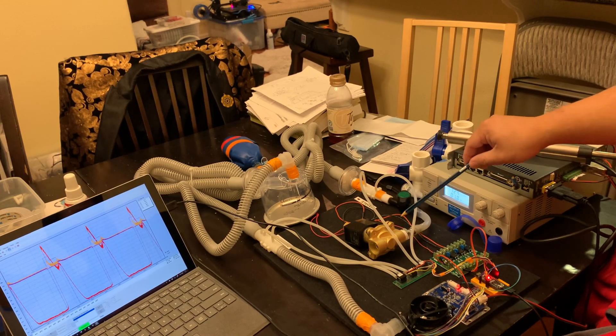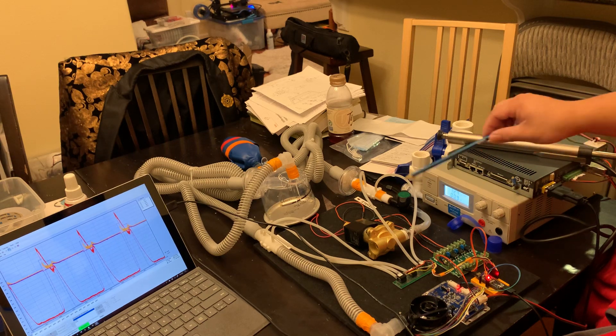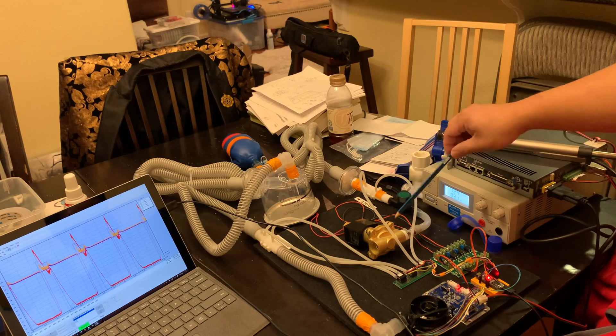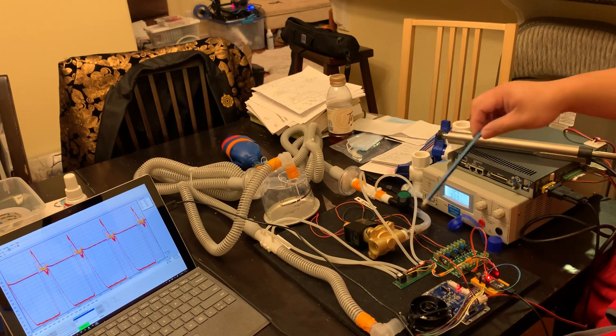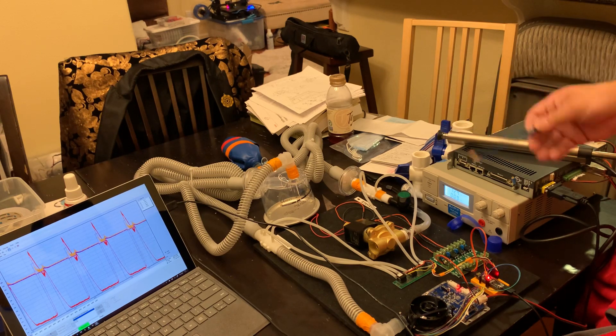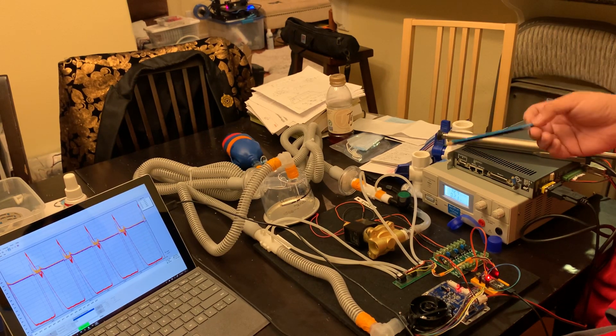The solenoid closes during the high flow inspiratory phase of the respiration and then opens during the expiratory phase. This solenoid is a normally open type so that if the solenoid does fail, the system will go back to wasting oxygen, but the patient will continue being able to breathe on the ventilator.